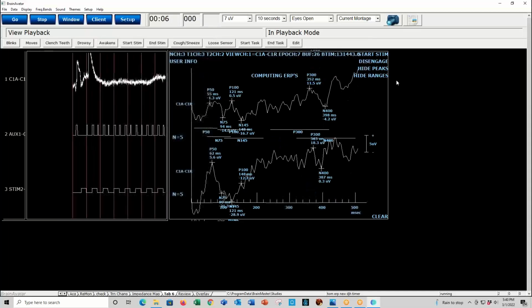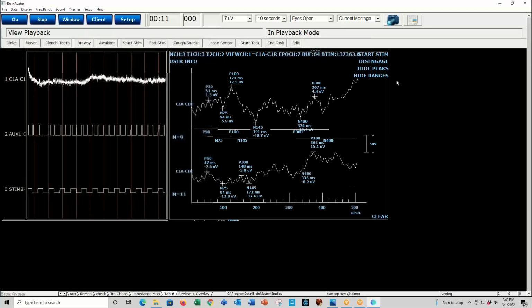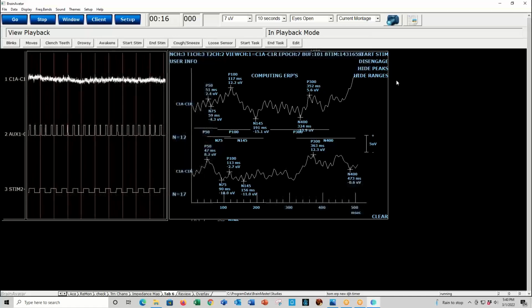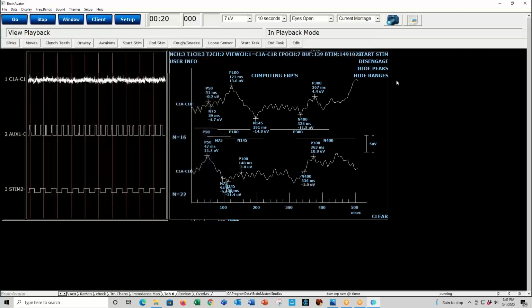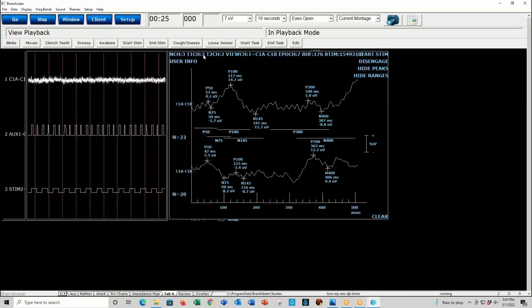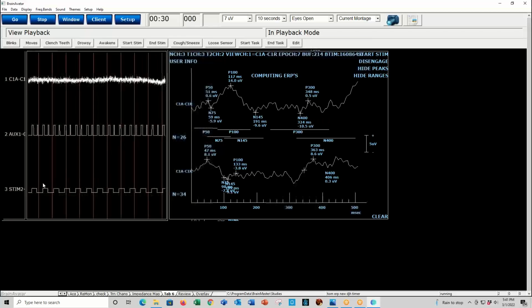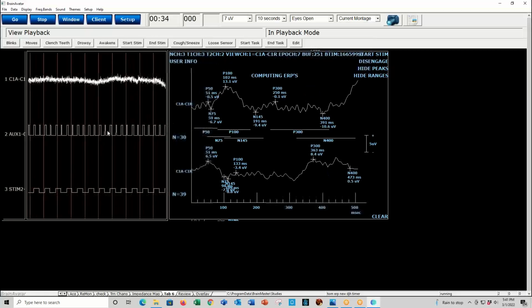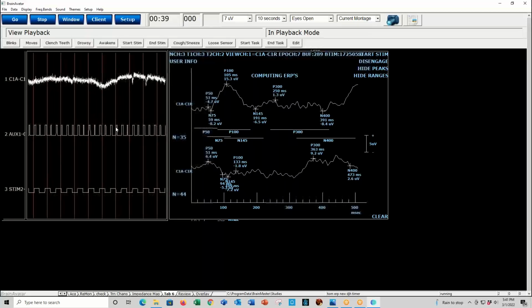And now you see as the pulses are detected, and the pulses are being detected on channel 3, we get the averages being added in real time to the signal, and the top trigger is the channel 3. You see T1 channel 3, which means the trigger for the top trace is channel 3, which is the stimulus pulse. And for the trace below it, it's channel 2, which is the light flash pulses, both directions, whether the checkerboard flashes one way or the other.